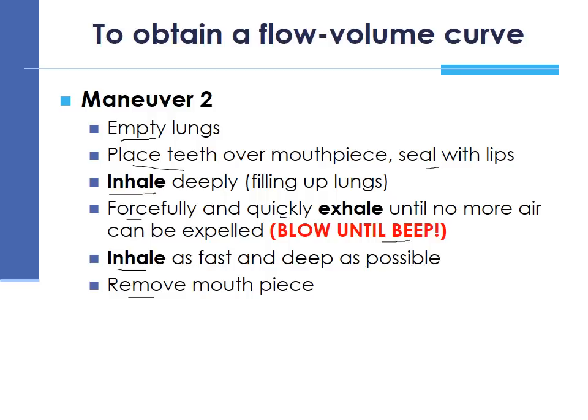So when going through the steps in this maneuver, we notice that the difference between maneuver 1 and maneuver 2 is that in the case of maneuver 2, the patient was not instructed to breathe normally for those first 4 breaths. So there's an immediate inhalation, a forceful exhalation, and then end off with another inhalation.